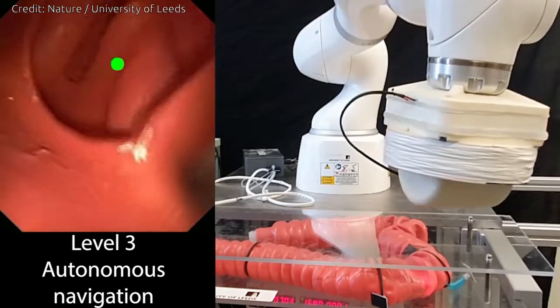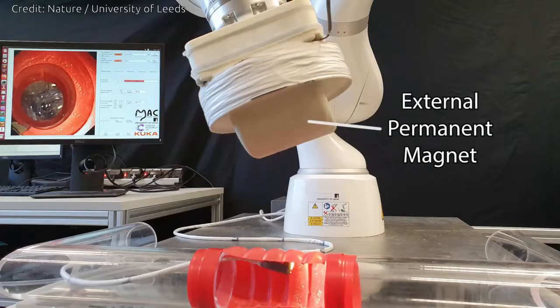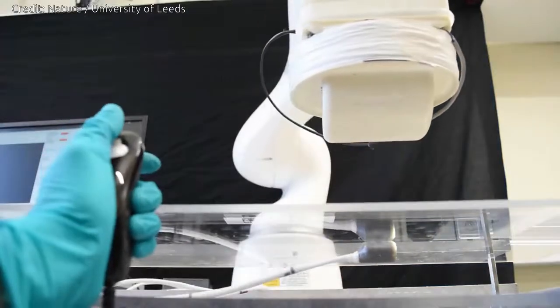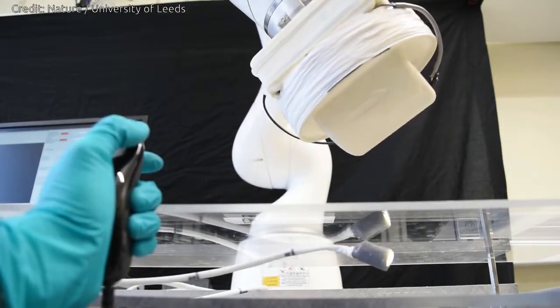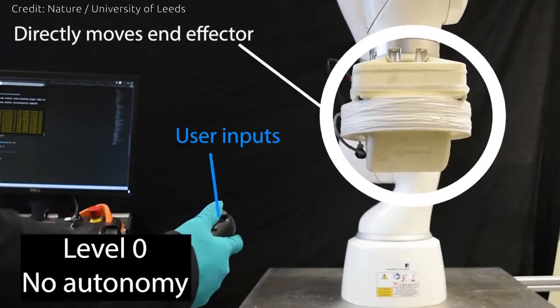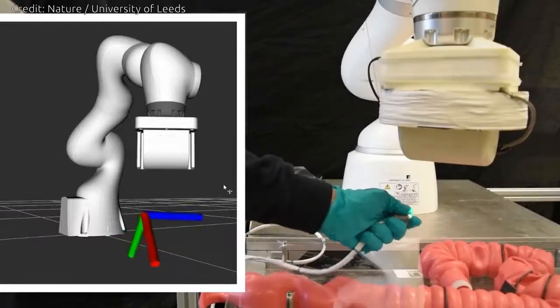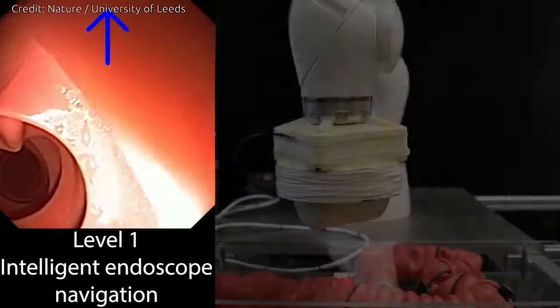The research team has developed a smaller capsule-shaped device which is tethered to a narrow cable and is inserted into the anus and then guided into place, not by a doctor or nurse pushing the colonoscope, but by a magnet on a robotic arm positioned over the patient. The robotic arm moves around the patient as it maneuvers the capsule. The system is based on the principle that magnetic forces attract and repel. The magnet on the outside of the patient interacts with tiny magnets in the capsule inside the body, navigating it through the colon. The researchers say it will be less painful than having a conventional colonoscopy.